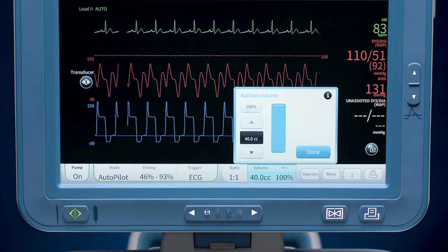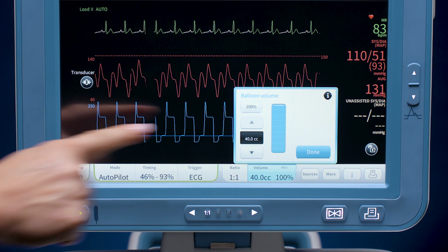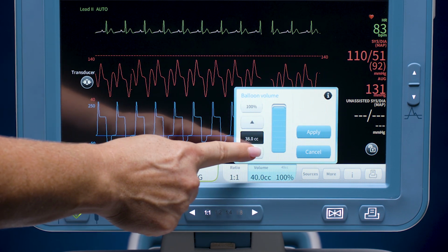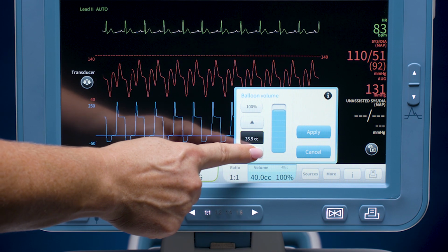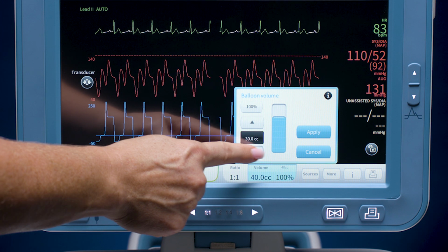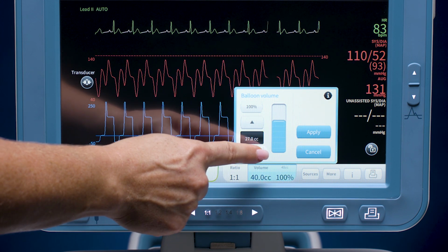However, when volume changes are required, the AC3 Optimus IABP lets you set the precise volume to be delivered to the IAB in 0.5 cc increments. The user cannot set inflation volume greater than the balloon's maximum capacity.